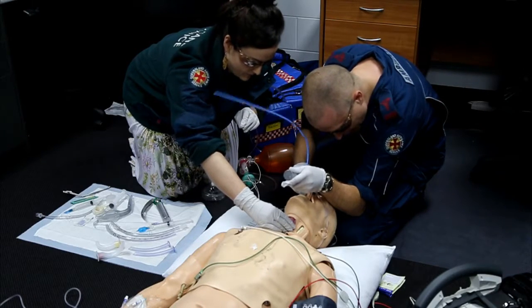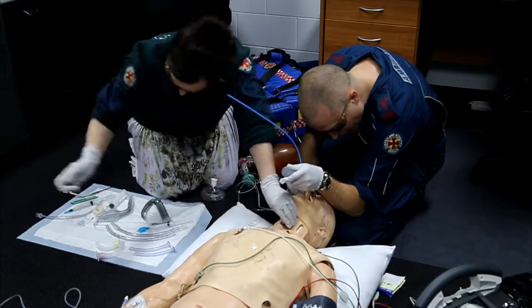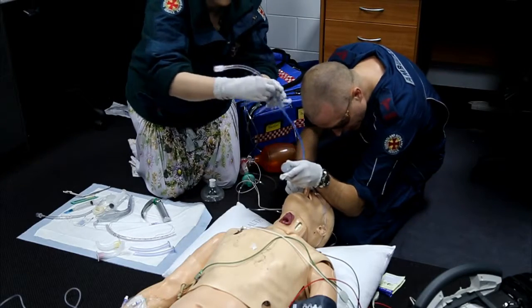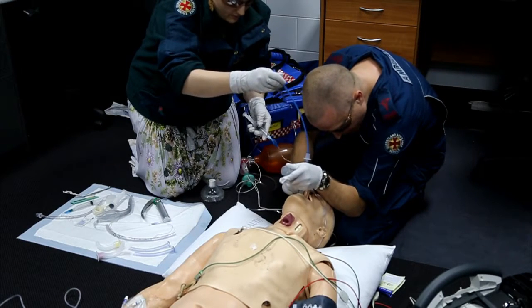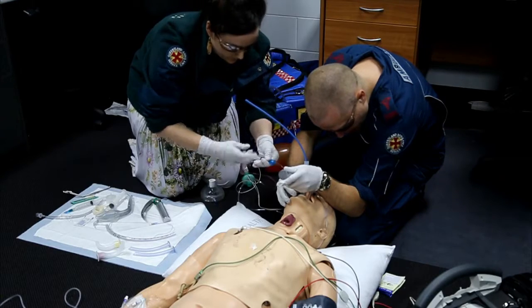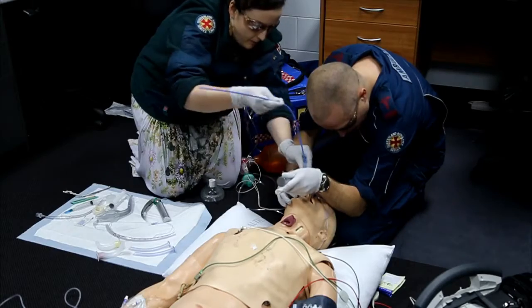I can't see, but I'll get you to railroad the tube. Cuff inflated. Removing the bougie. Thank you.